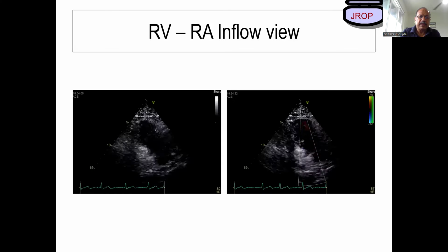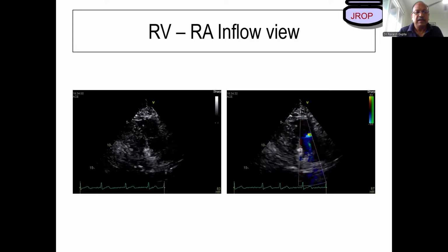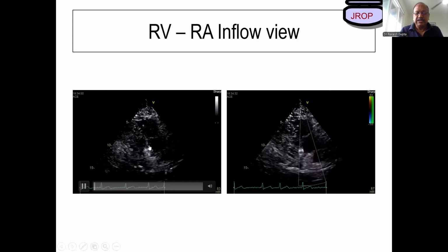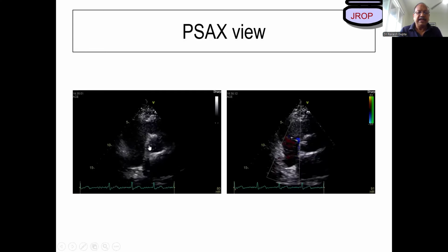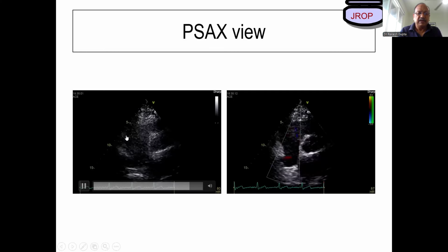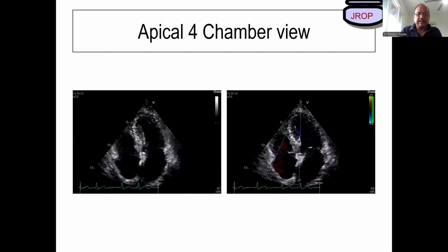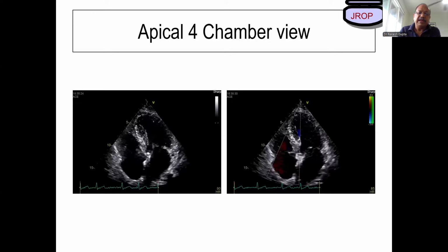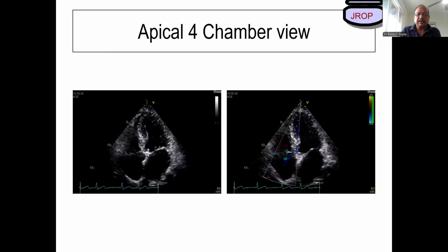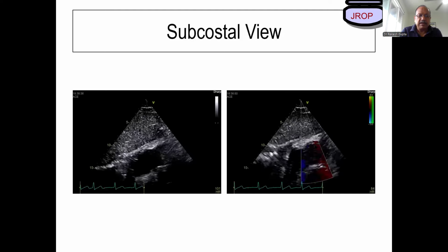Anterior and septal. This one is the septum. You forget so easily. And here, see, this is what? Posterior. The posterior and anterior, or posterior, septal. Okay. Septum, and anterior here, near the aortic wall, and posterior at the lateral side. All right.